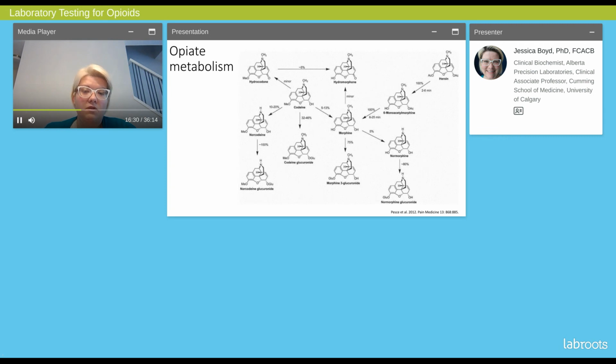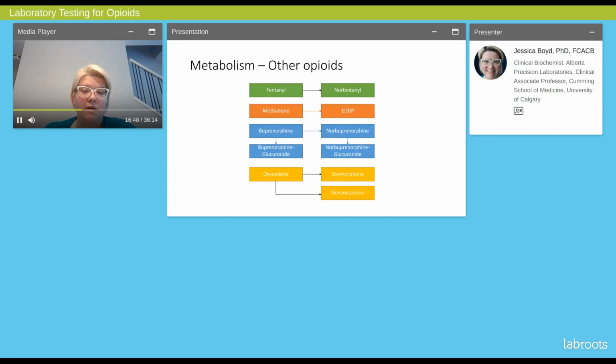So this is another caution about acting on a urine opiates result, because if it's positive, even if it's a true positive, you don't know whether that positive is coming from codeine present, morphine being present, or heroin and its metabolite being present potentially. So again, why mass spectrometry is really important so that we can speciate those out and give that information to the physician.